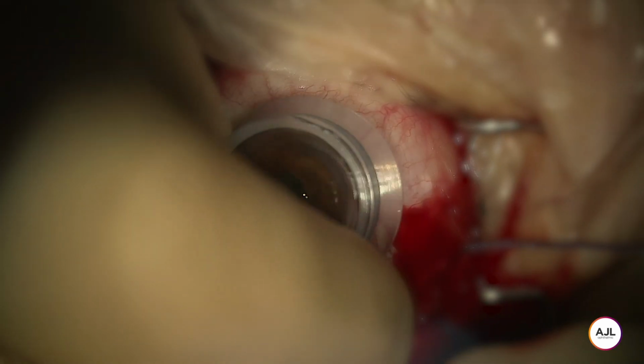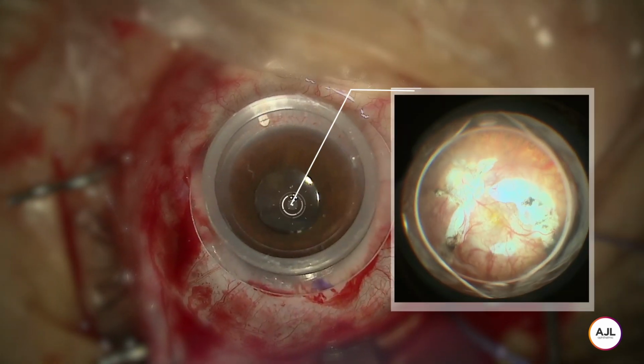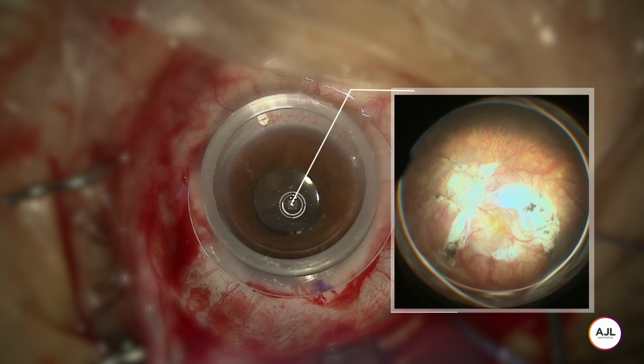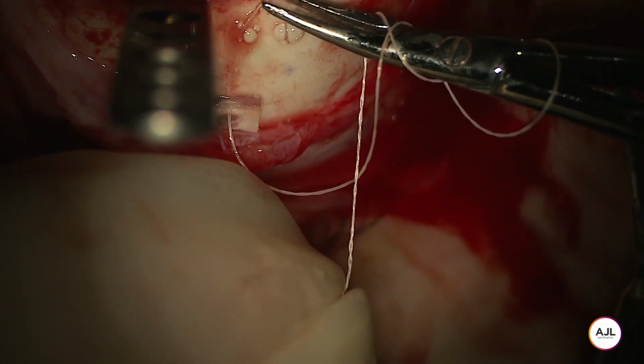A flat contact lens is applied on the clean cornea. The fundus is checked through the microscope and the flat lens. Subsequently, a temporal suture will be performed.